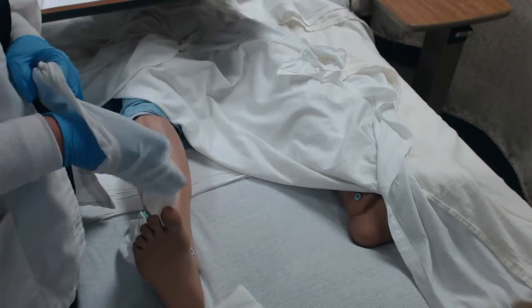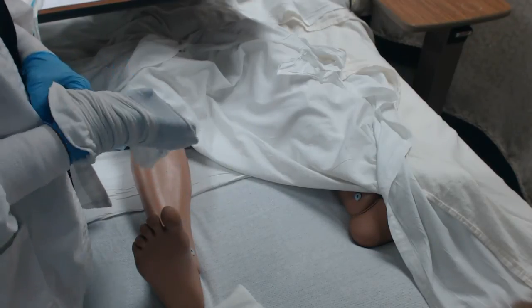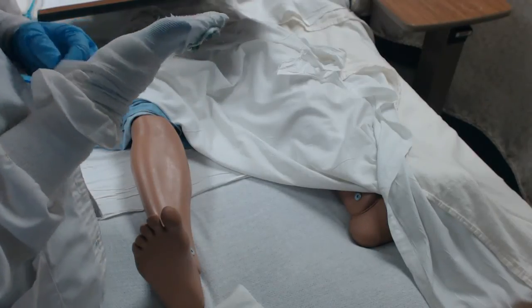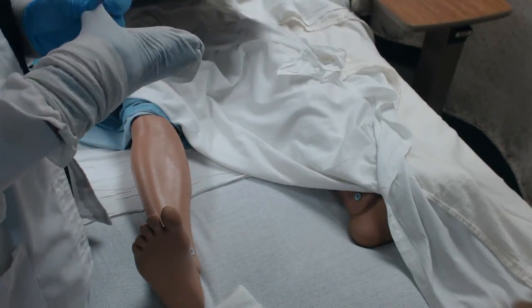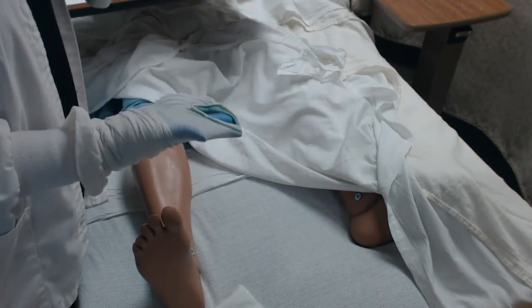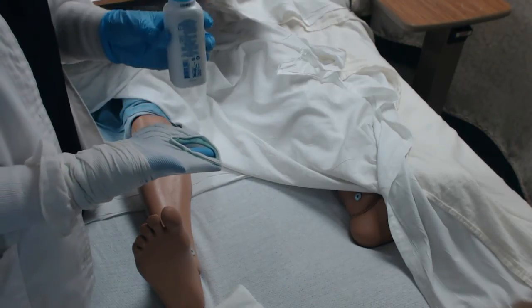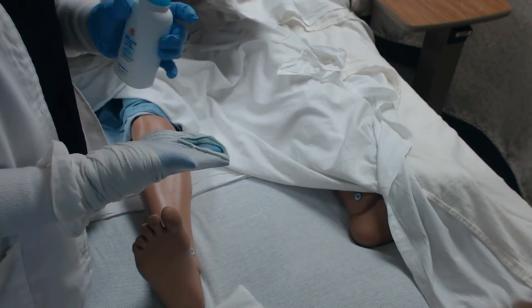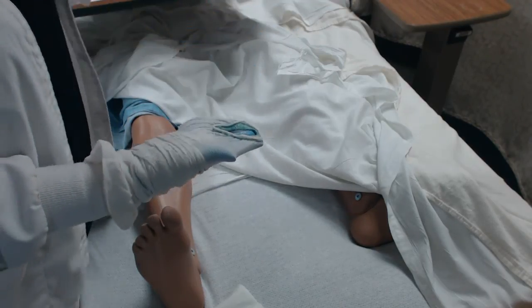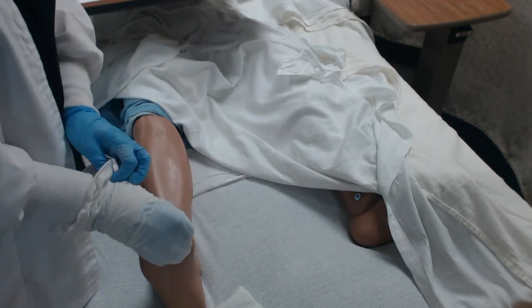Another tip I always show people is if you're really struggling, especially when you've just bathed the person, or you're just struggling in general with it. Another great thing that you can do is you can take it and put on your hand like you would normally, like I just taught you. And if your patient does not have any respiratory issues, you then can give a nice generous amount of baby powder. That will help the piece to slide on a little bit better.